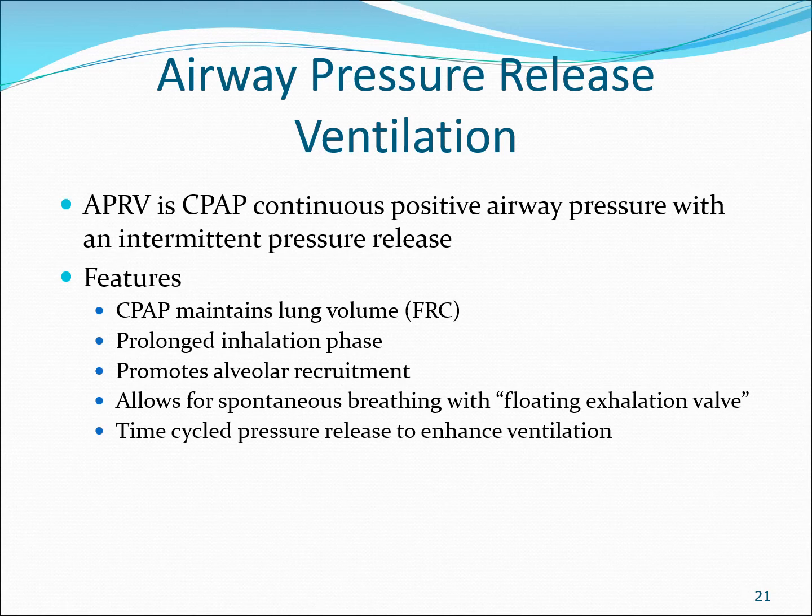It pops open collapsed alveoli. And then the second part of this is it has what is called a floating exhalation valve. And what does that mean? If you had inverse IE ratio pressure control ventilation, you cannot breathe above the vent. You need to be paralyzed or sedated. But with APRV, because of the technology of this floating exhalation valve, you can breathe above this.